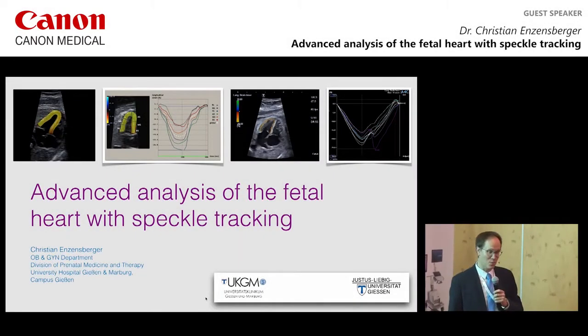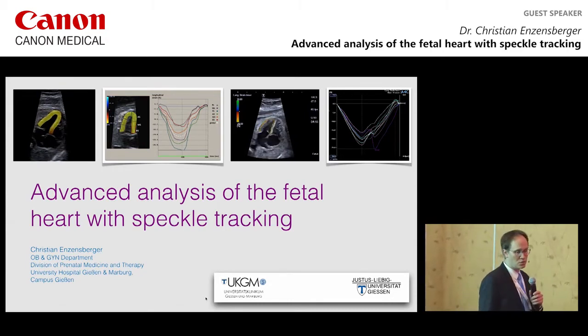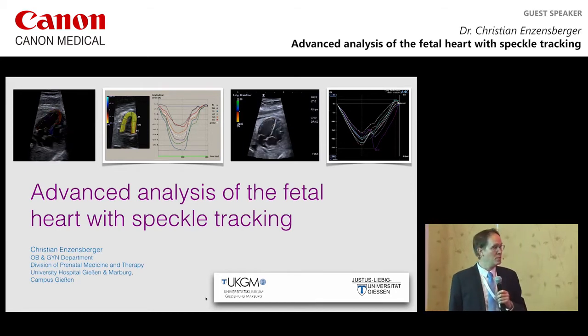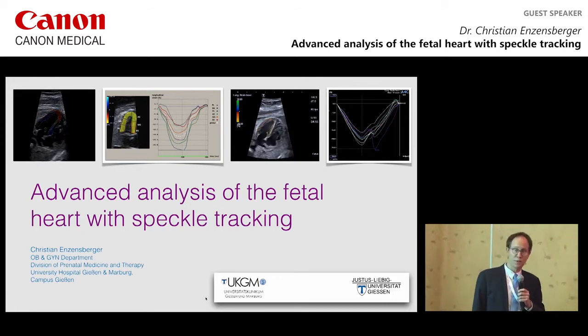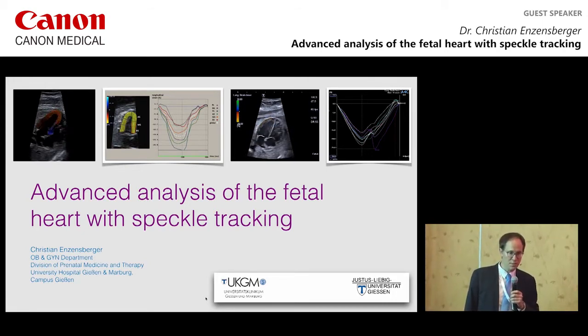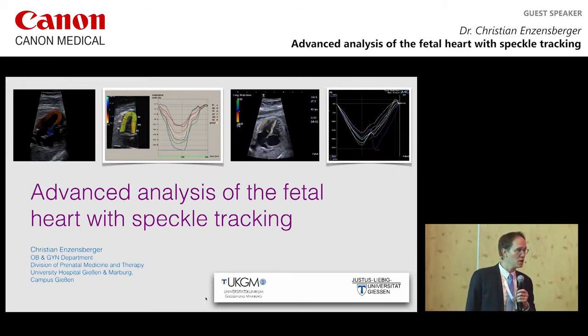What's the reason why we are talking about speckle tracking? We know that fetal cardiac dysfunction often appears subclinically, and therefore it might be missed or remains undetected by conventional methods like Doppler ultrasound or CTG. Now, to improve fetal cardiac monitoring, new tools like speckle tracking are available in the meantime, and I would like to show you some clinical situations in which we can implement these tools.